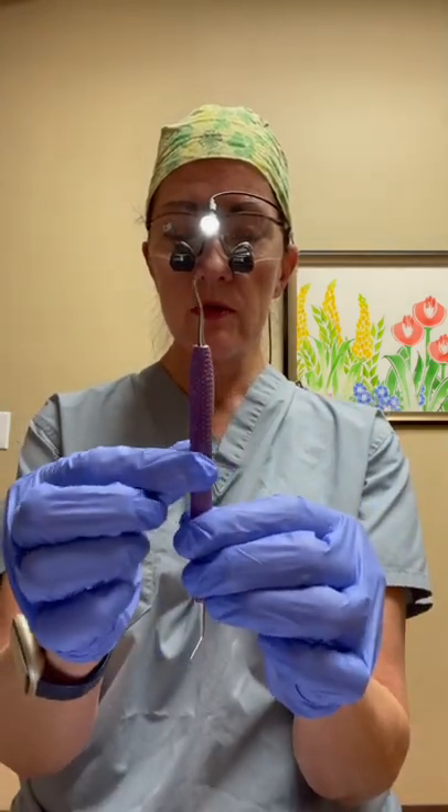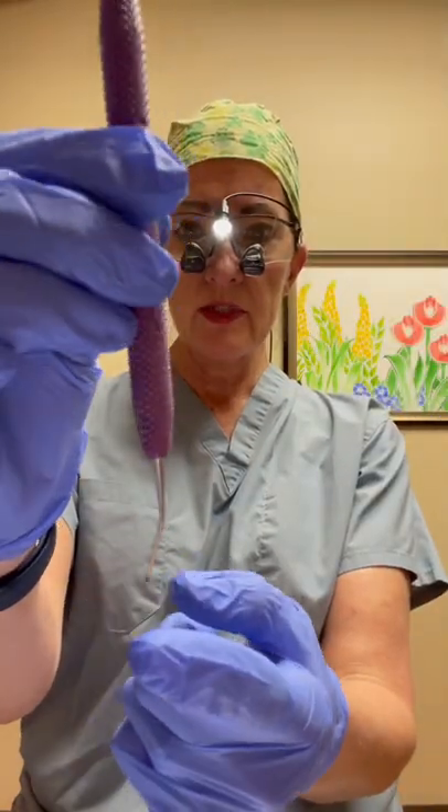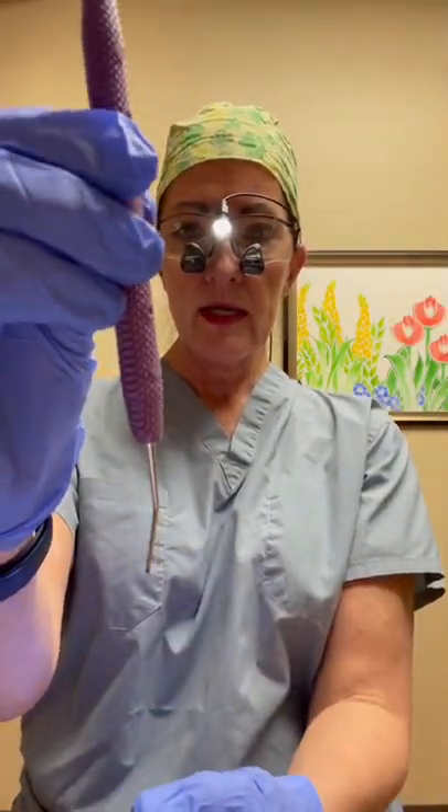I was recently asked how do you sharpen instruments that look like a spoon or a scoop? I'm going to demonstrate on one of Trish O'Hare's instruments, where it has the sickle on one end and then the little scooped end on the other end.